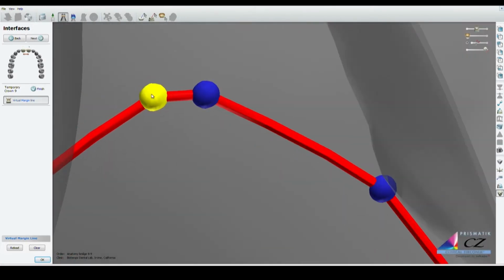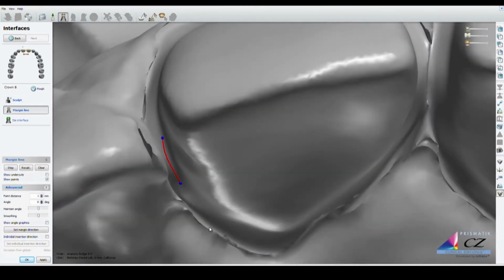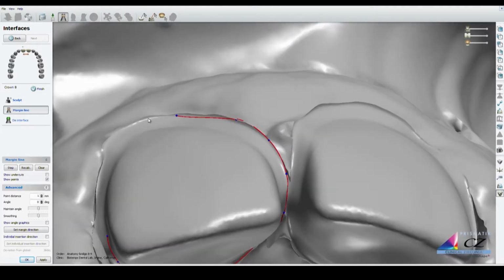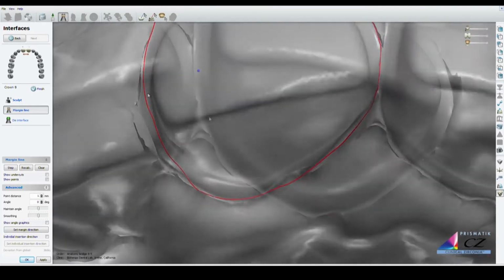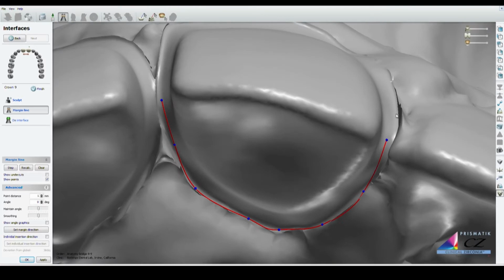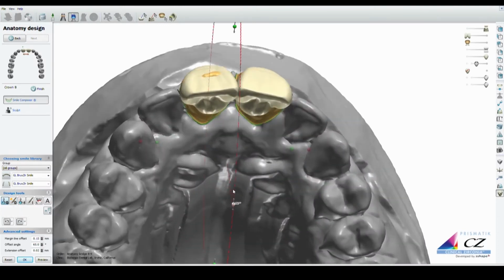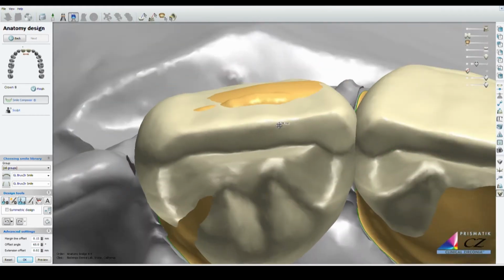And once that location is completed, we can go ahead and do what we call a virtual prep. What I really like about the virtual prep is that it creates a minimum thickness that's uniform all the way around the preparation of the tooth structure. And that way you can get a restoration, a BioTemp back, that's uniform in thickness. And the other reason that I really like the uniform preparation is that it's extremely thin, so you get a thin shell back, and you have more options of being able to seat this restoration on the preparation because you can minimally prep the teeth if that's what's required.